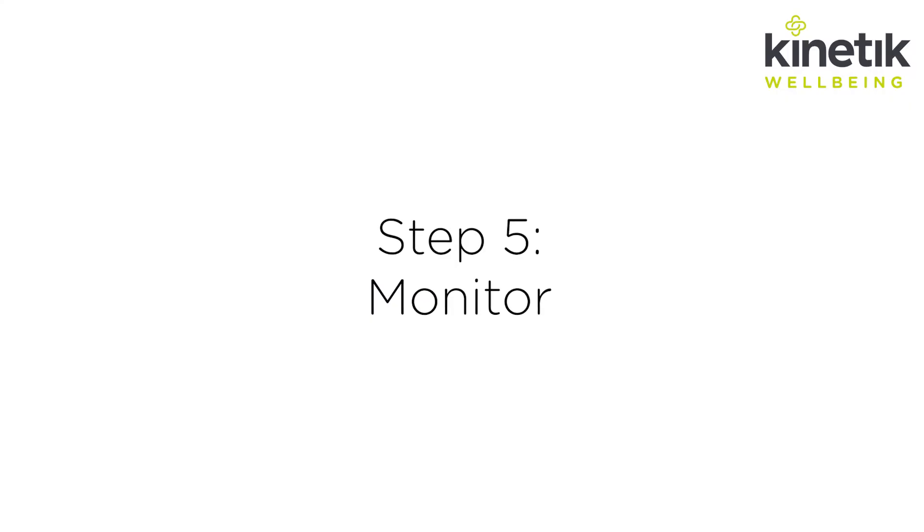Step five: monitor. It's a good idea to check your blood pressure regularly. If you're concerned about your reading, speak to a healthcare professional.